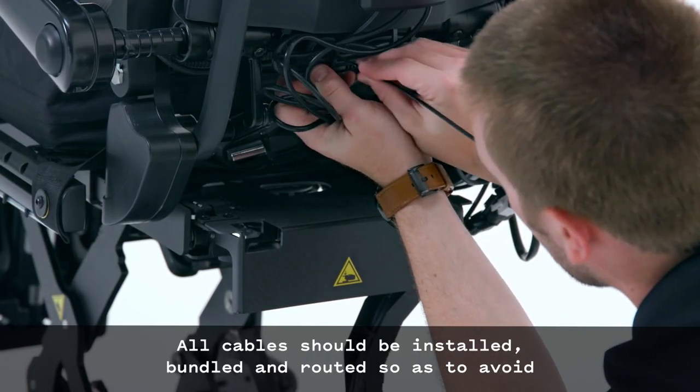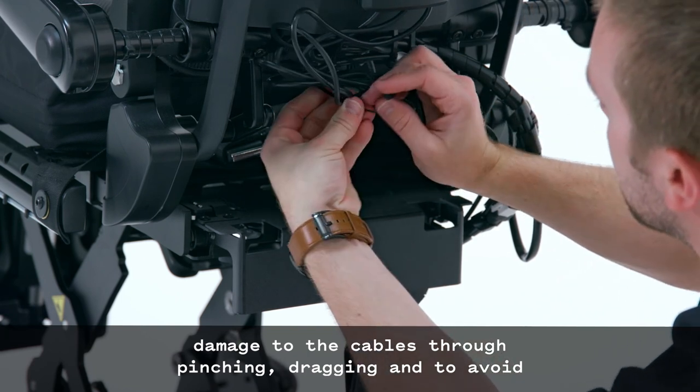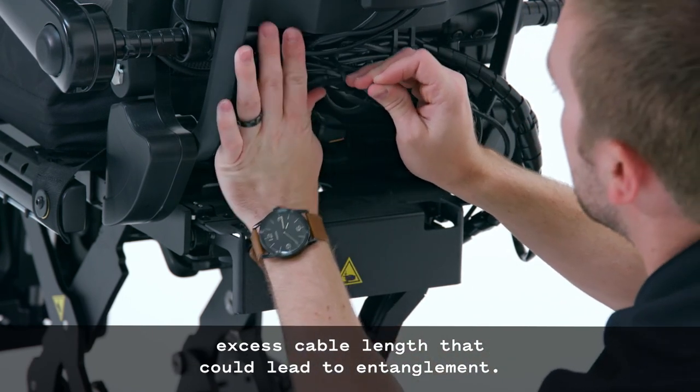All cables should be installed, bundled, and routed so as to avoid damage to the cables through pinching and dragging, and to avoid excess cable length that could lead to entanglement.